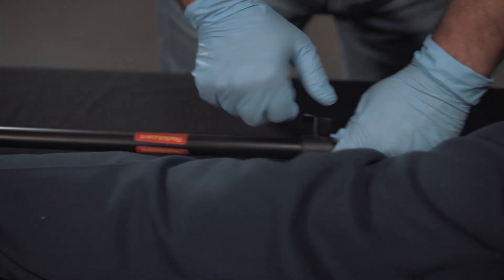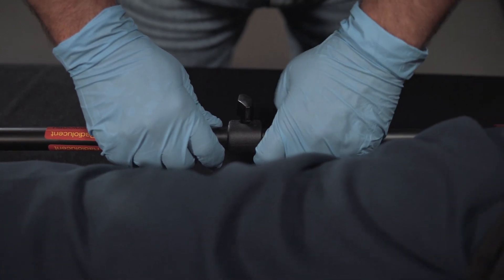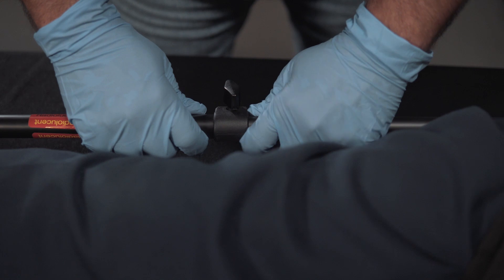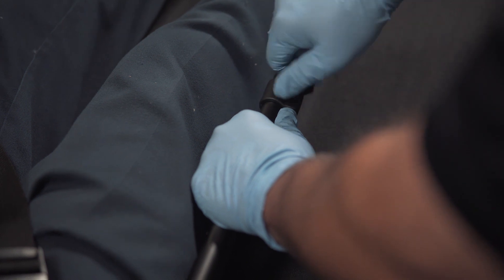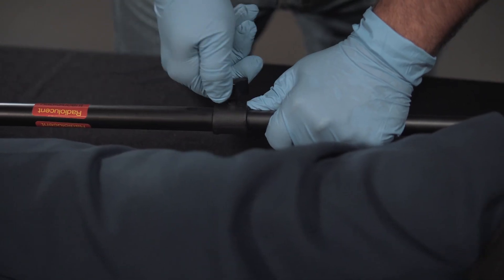Once everything is in place, we're going to undo the middle screw and gently start to apply manual coarse traction. You'll feel it and see it once it's in place. Once it's there, we're going to tighten this screw down, and that will hold the coarse traction in place.